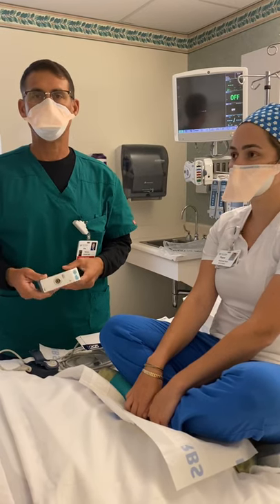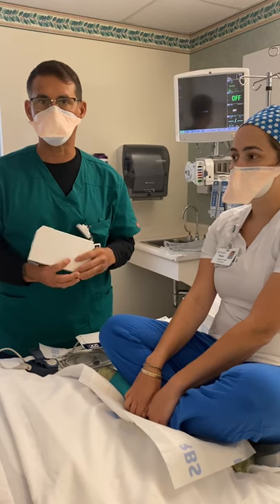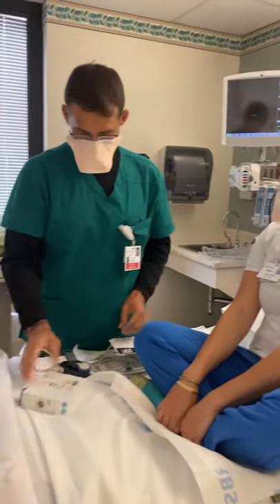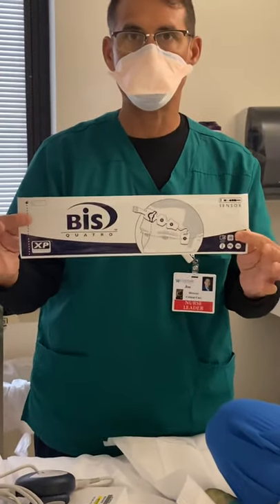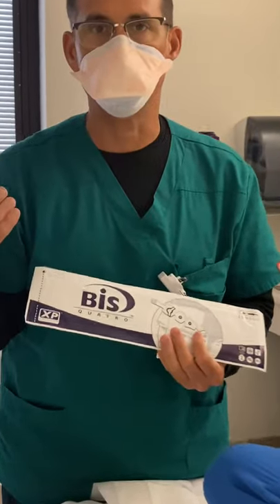Hello, we're going to do a quick instructional video on how to use your BIS and what it's for. These are the different parts. This is the BIS module, and this is the cable and the interface, and this is the packet of leads that you use with the BIS.